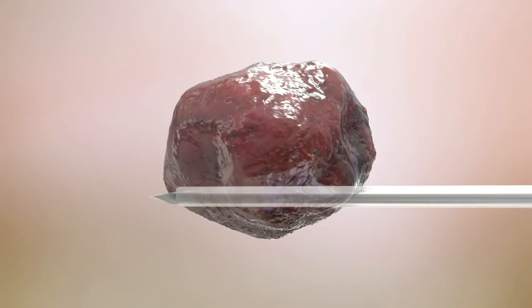The stylet is removed, and the laser applicator is inserted into the catheter and locked into place.